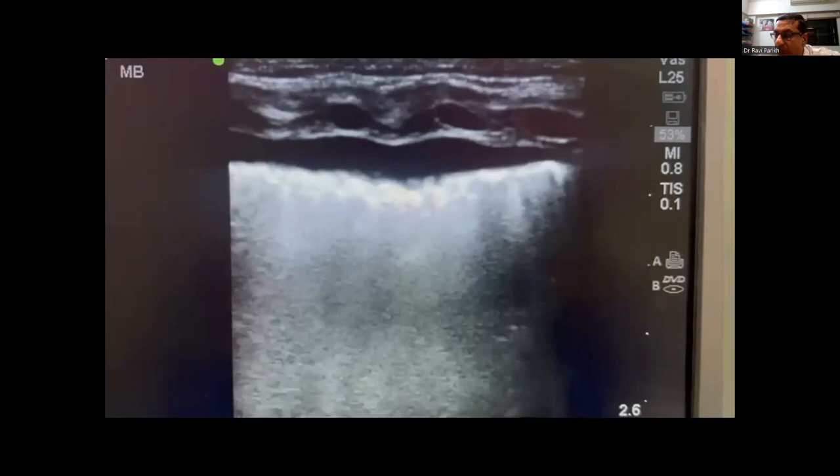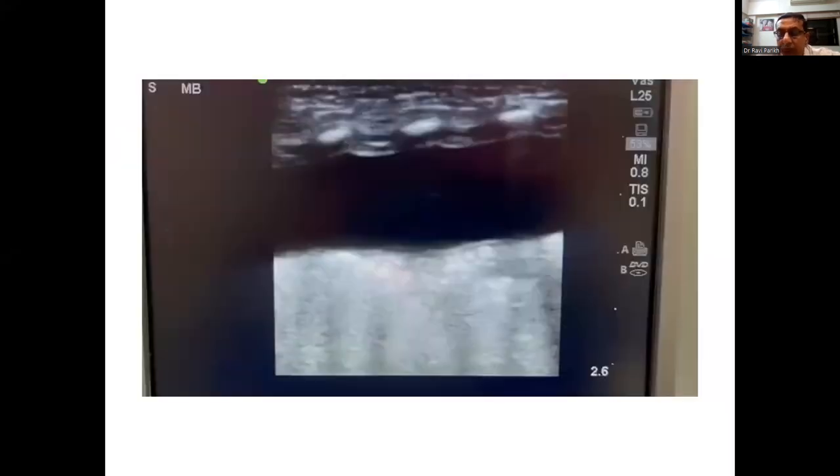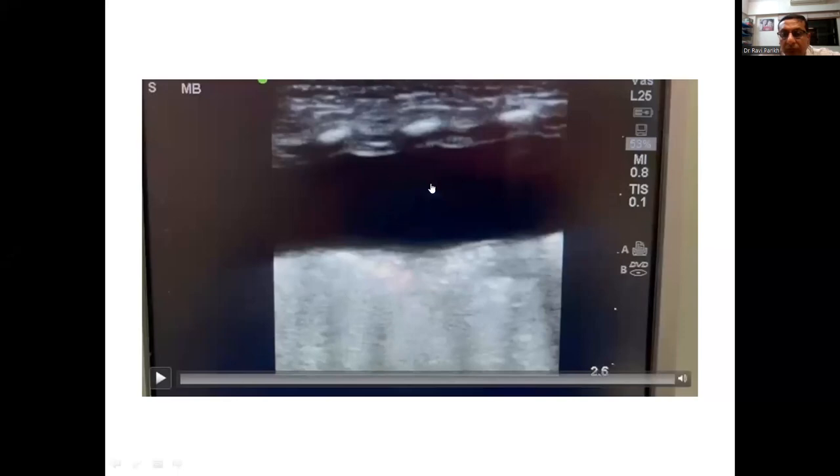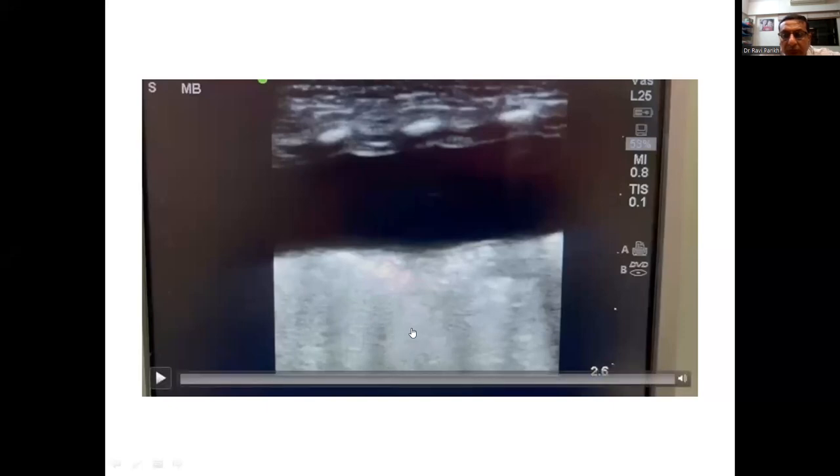So did you tap this baby? Yes, I could see these pictures, this view in almost all the areas. Yeah, and you can see it when it gets larger. Yeah, I tapped, it was larger. And when I tapped this, somehow I remember, but I couldn't capture the videos. Immediately after tapping, when I did a lung ultrasound, this whole effusion had disappeared. And the B profile turned into A profile, absolutely A profile with no B lines. And that is immediately after tapping, on both sides? On both the sides. And I could see very good A lines with no consolidated areas and a very good lung aspect.